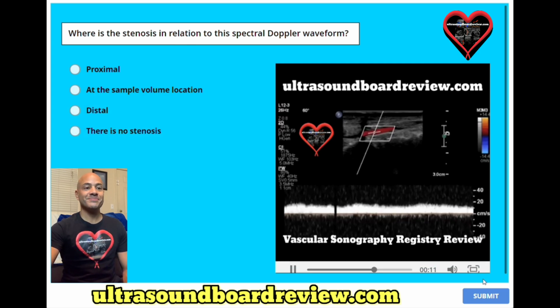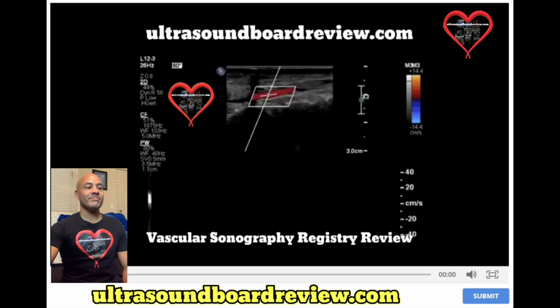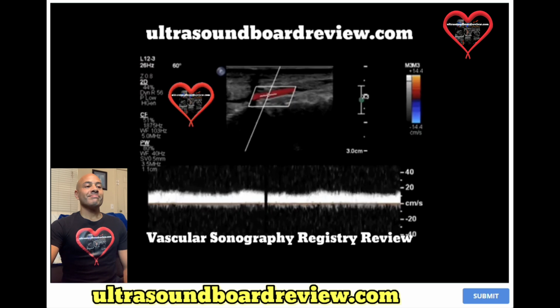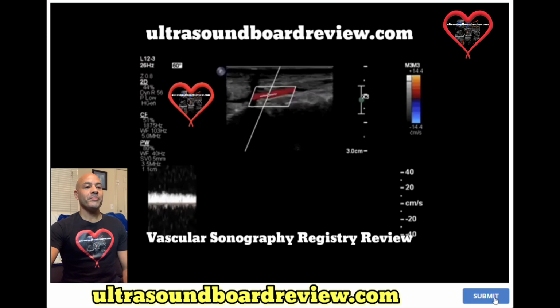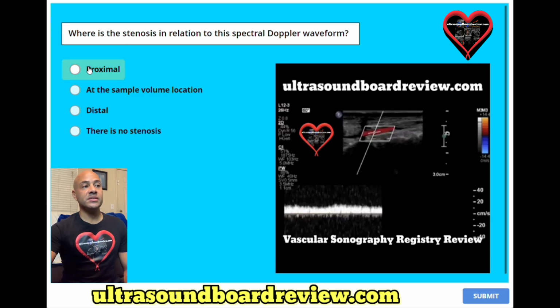Or D, there is no stenosis. The answer is A, proximal.